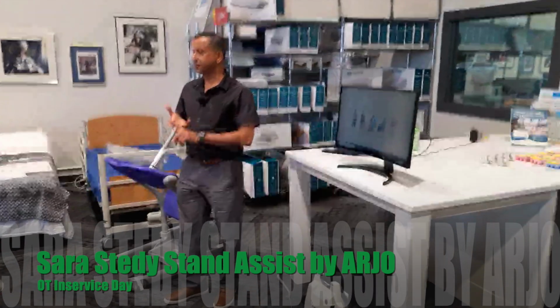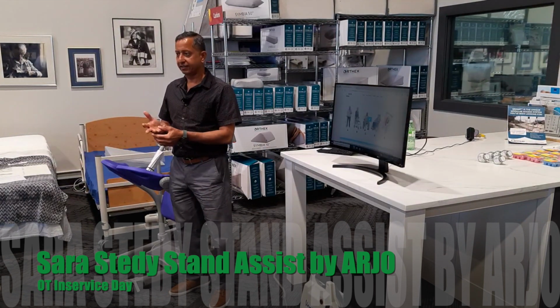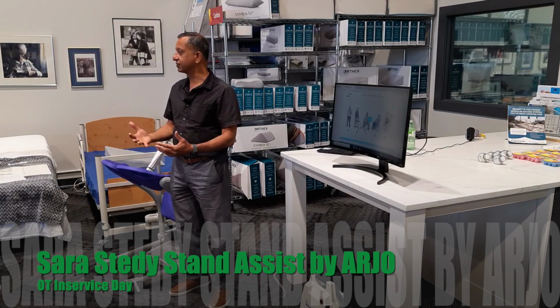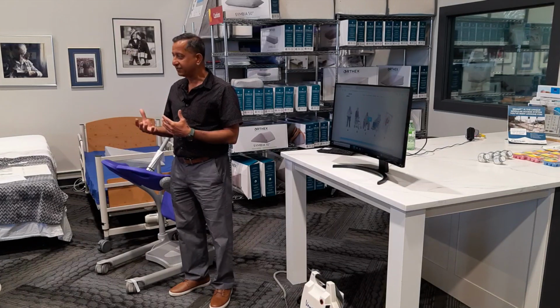We have 3 different divisions. One of them is called patient handling. Patient handling is mainly ceiling lifts, floor lifts, slings, that kind of stuff. Then we have the hygiene division.